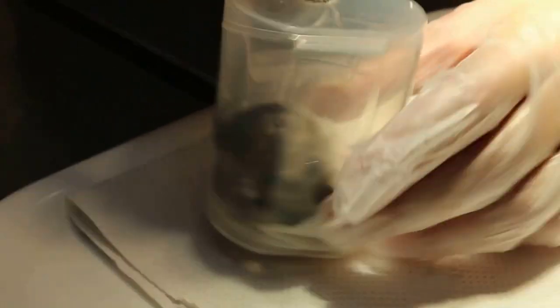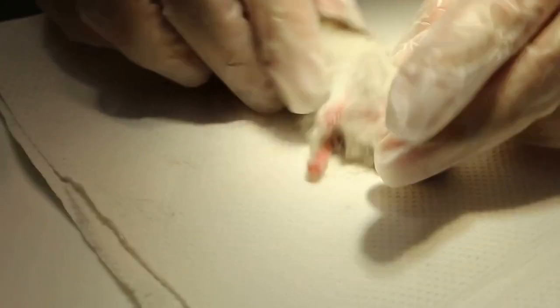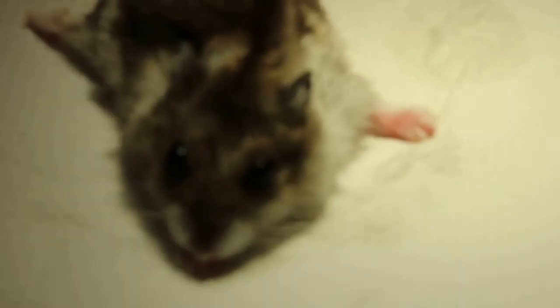So now he's down already. So I'll take it out here. Now, we don't bother with the other side. So you can see the wart. There's a wart here. So I'll take the plate, put it on the electrode plate, and actually you can see from here the wart is here, but it's below. So I put on the plate and you can see this wart.